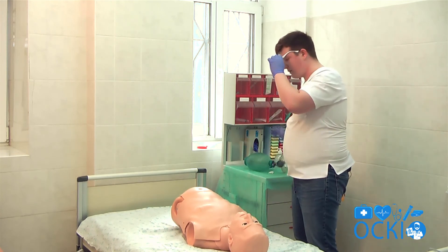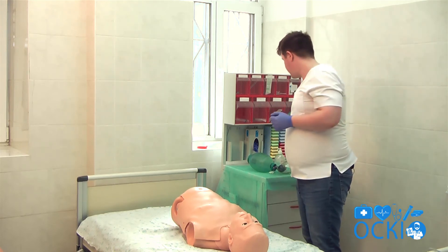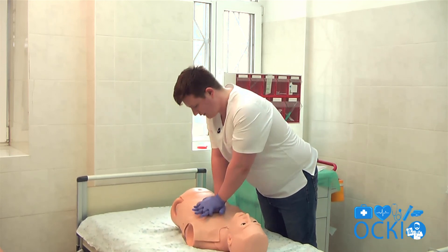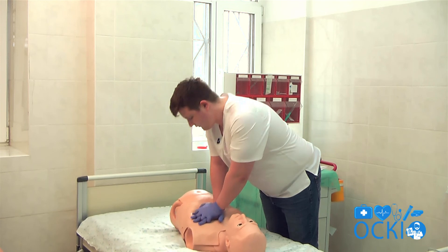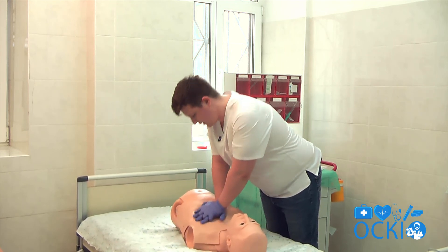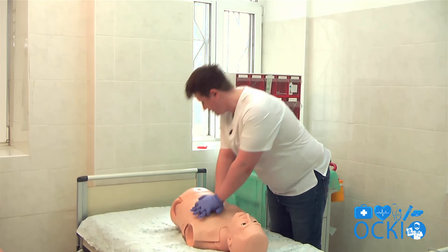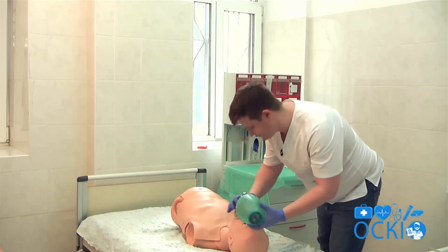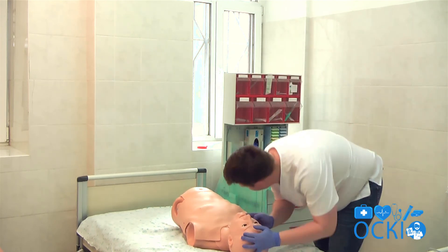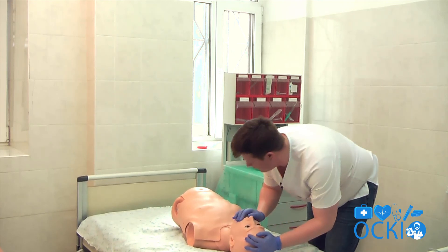When you hear the signal indicating one minute remaining, perform one more complete CPR cycle of 30 compressions and 2 breaths. Then once more check the patient's condition: breathing, circulation, and consciousness.